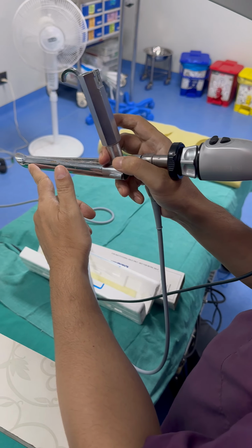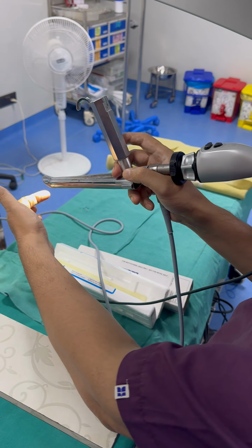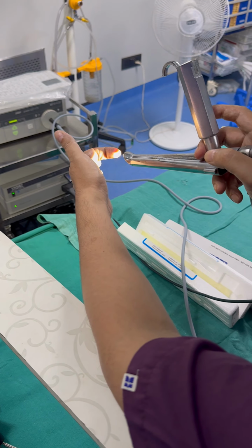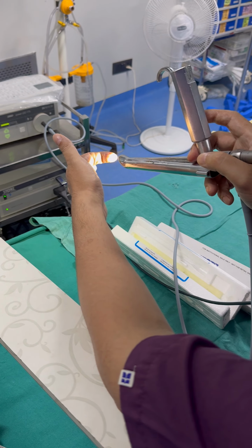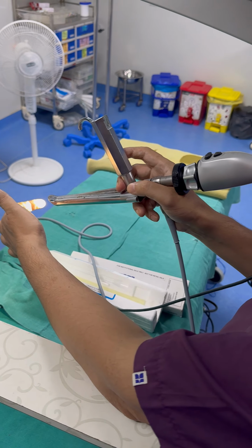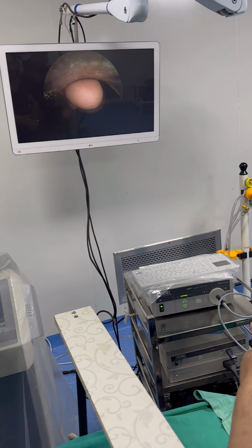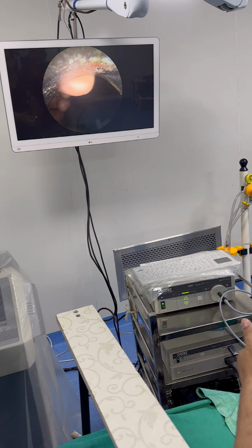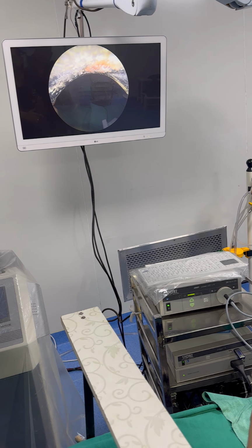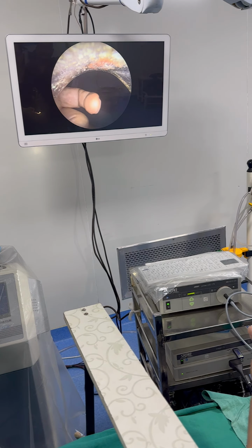In the endoscopic laryngoscope, the advantage is that when the 0 degree endoscope is applied, we can see this 0 degree angulation, and we can see up to 30 or 40 degree angulation. Things can be visualized, and by tilted instruments we can operate on those patients. But by changing the endoscope to 30 degree, 45 degree or 70 degree, the vision will not improve, because the limitation is this flange of the laryngoscope. So just changing the angle of the endoscope will not improve the vision. We have to work with this 0 degree endoscope, and almost all lesions are visible with it.